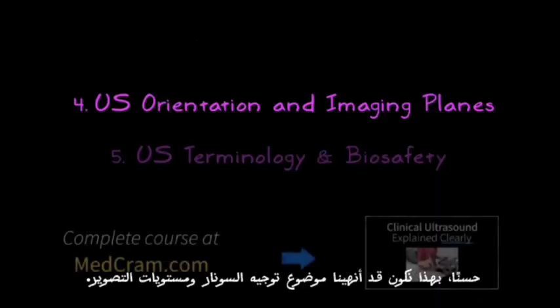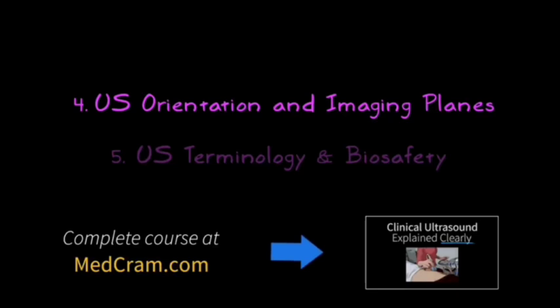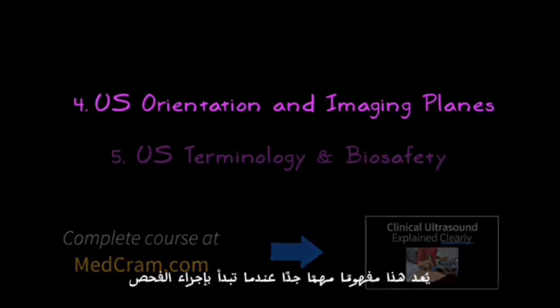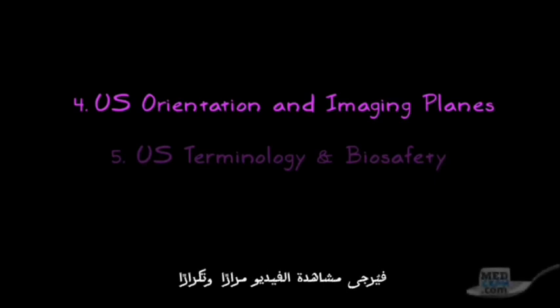All right, well that wraps up ultrasound orientation and imaging planes. This is a very important concept as you begin scanning, so if you didn't feel you caught those concepts the first time around, please watch the video over and over again until you really feel like you've got it.